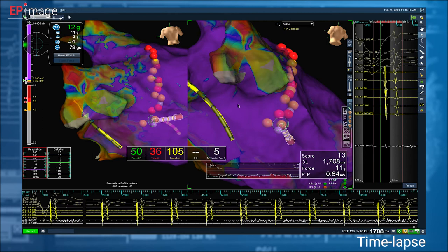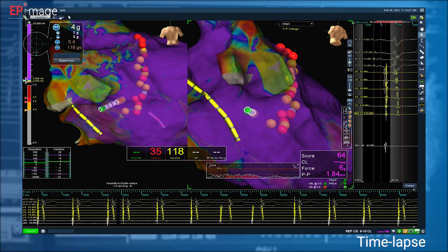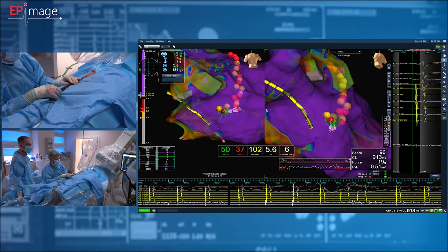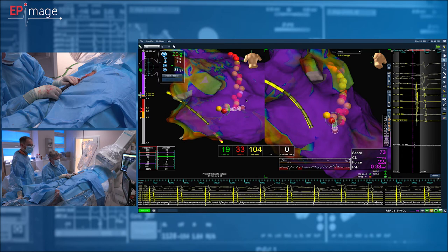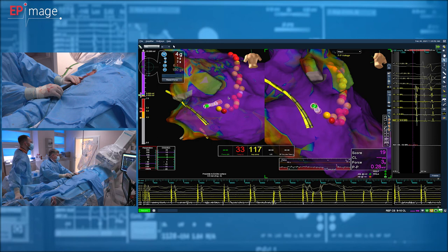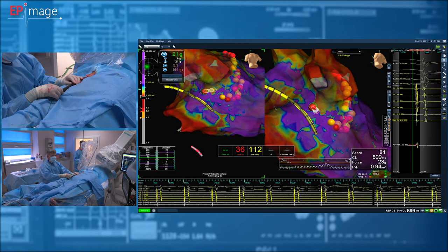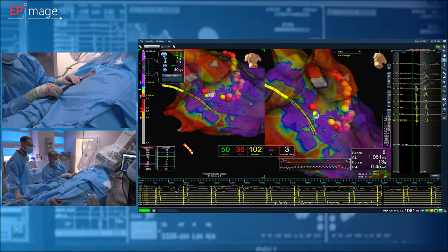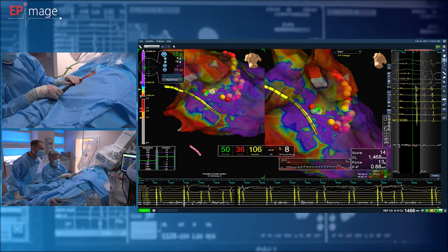These shallow lesions are deep enough to have the full transmurality of the lesion. So in fact, when you think about the thickness of the left atrium wall, you will think about 1.5, maybe 2 millimeters of thickness. And high power ablation is ablation whose depth is about 2-3 millimeters. So in most cases, if there is no local hypertrophy, it's more than enough to have transmurality of the lesion.